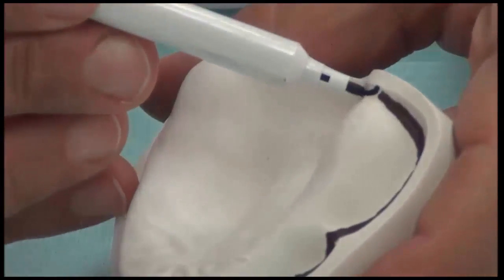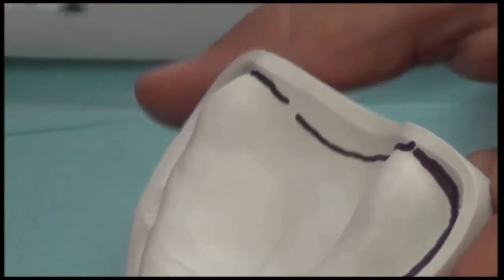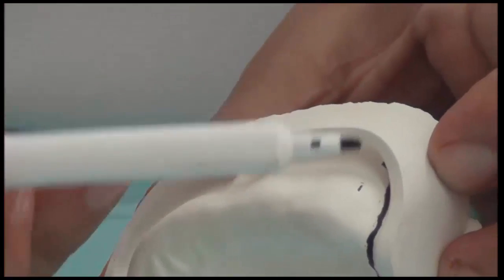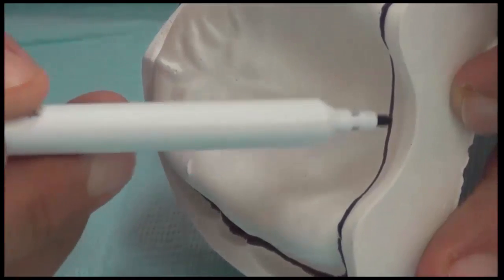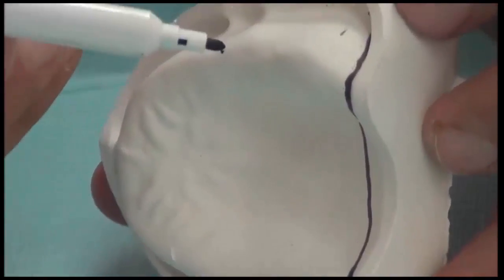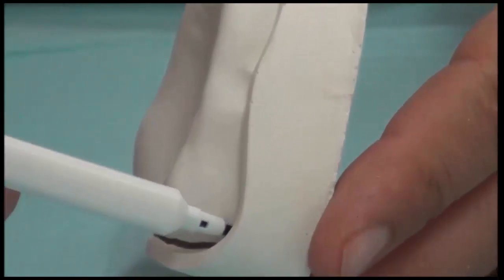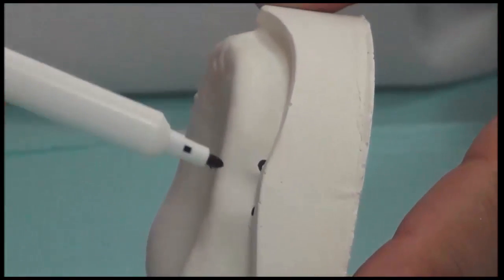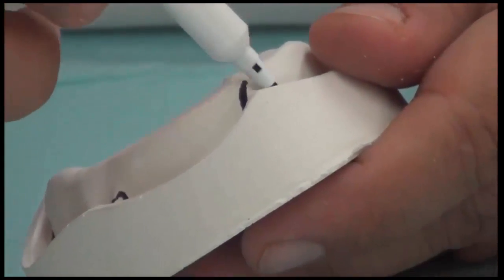We also go inside the hamular notches. From the hamular notch to the hamular notch, for tray purposes, we make it straight. And then we will change it later on. But as a tray, the tray should be extending from hamular notch to hamular notch to record this area, which we'll be using for the post-dam later on. We will be talking about that later. So from hamular notch to hamular notch in a straight manner, vertically in the sulci, up and down on the freni area, and going to the labial frenum. This is what we call the full sulcus depth.